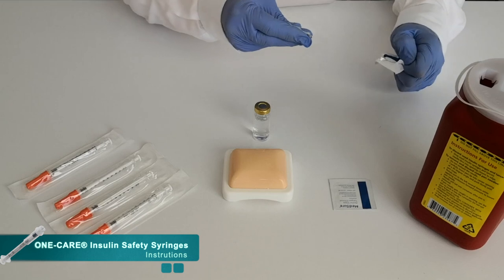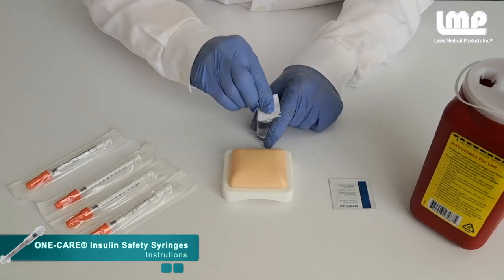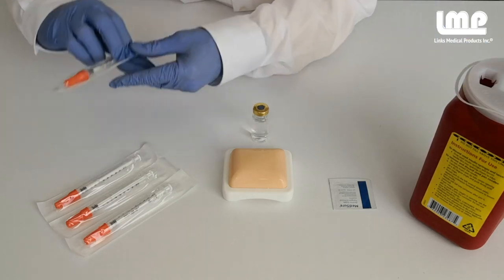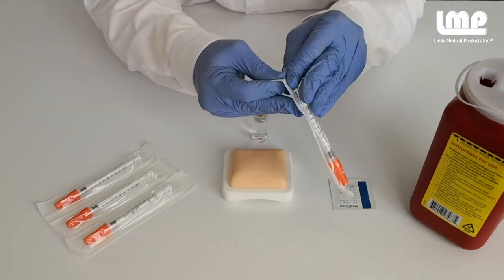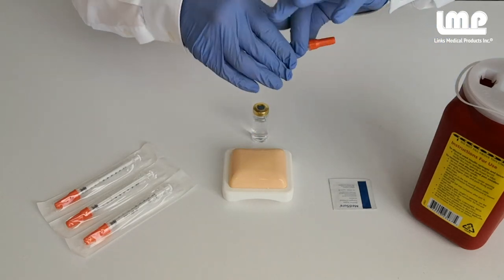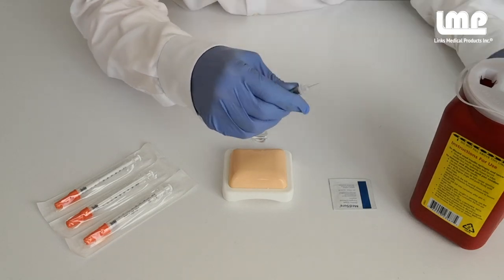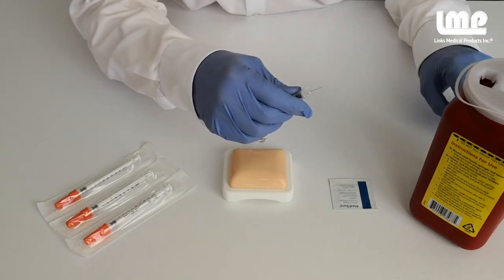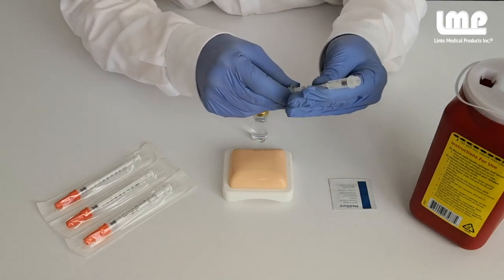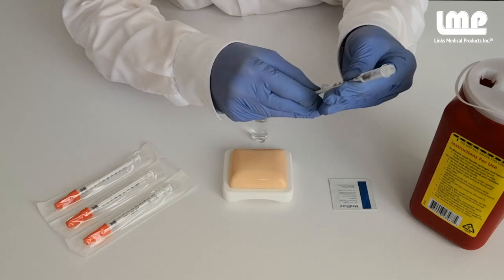To begin, cleanse the vial. Remove the syringe from the blister pack. Then take off the color-coded protective cap. Follow your institution's guidelines to draw up the medication.